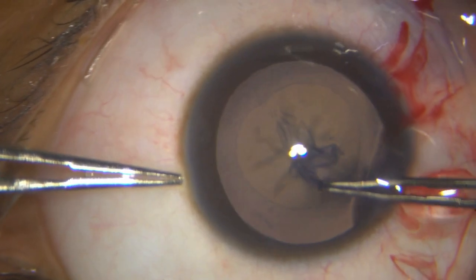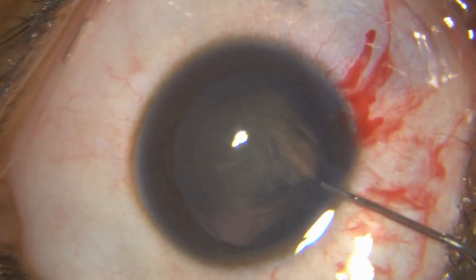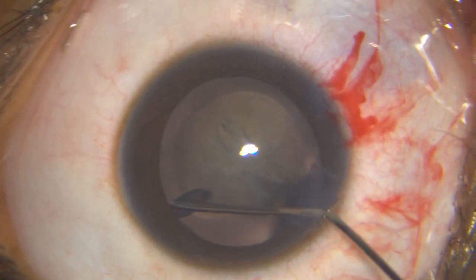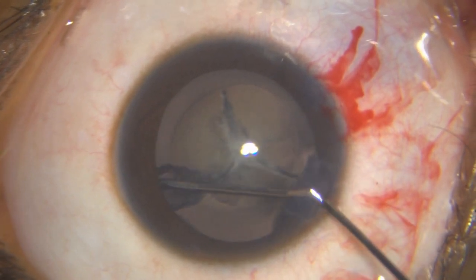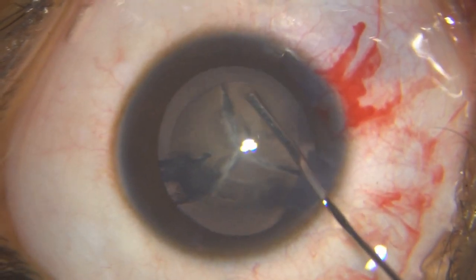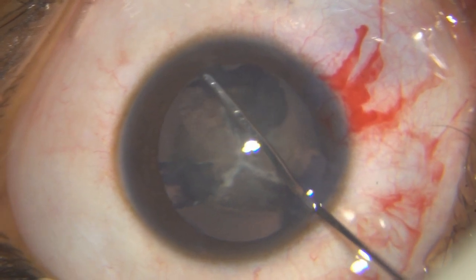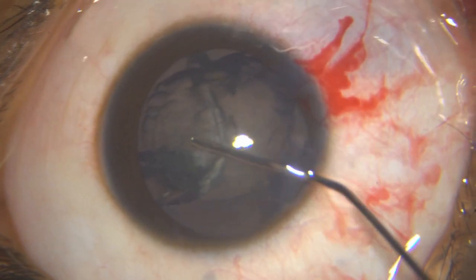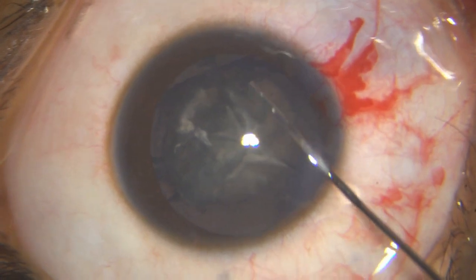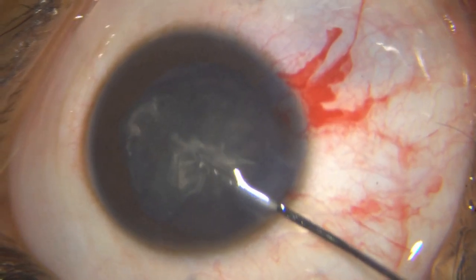Once I have done that, I watch what happens when I hydrodissect. Look — it doesn't go posterior; in fact, it goes along the suture line. Did you see how nicely it separated the lens into three segments? I try to do a little more hydrodissection but I am not getting the capsulo-cortical plane, so I abandon that and just loosen up these segments. Superiorly it is still not separated, so I put in some fluid there.